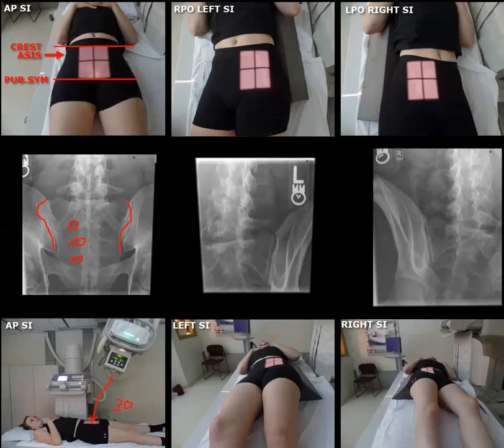And so when we are in RPO position as a patient, it is our left SI joint that is visualized. For this, we want to rotate our patient up on a wedge, and we want that degree of angulation to be approximately 20 to 30 degrees. And we can utilize this foam wedge that's here, trying to get that 20 to 30 degree angulation of the sacroiliac joints. For our central ray, we just need to be approximately 1 inch medial to the ASIS.